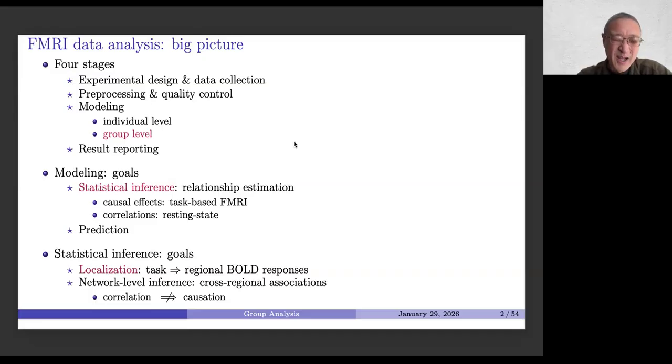In fMRI, most of the time, people ignore the response amplitude and focus on the statistic, and that is further binarized, right? Either you say each brain region is associated or engaged to some extent with the task. Once you binarize the results, we ignore the uncertainty. But in reality, regardless of how strong or weak your evidence is, there is some extent of uncertainty. That uncertainty is typically ignored when people write up their results. So that creates some problems.